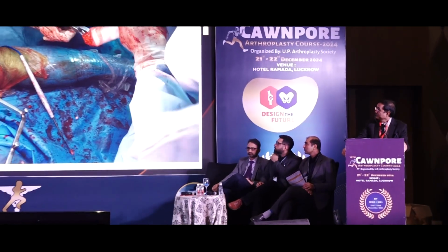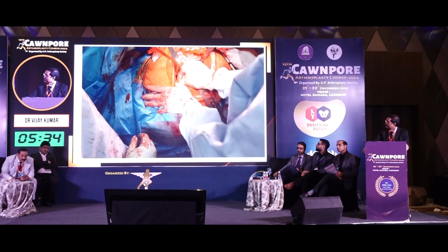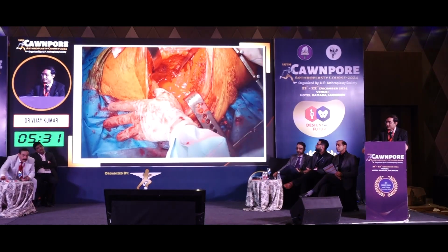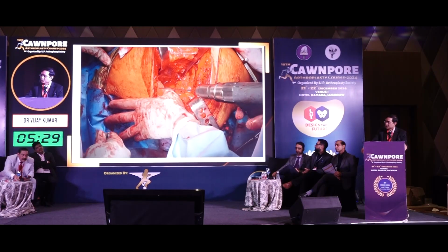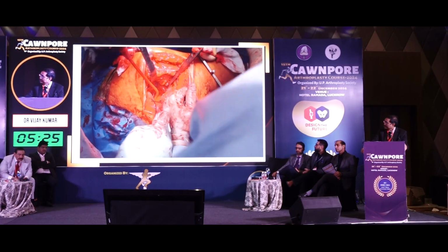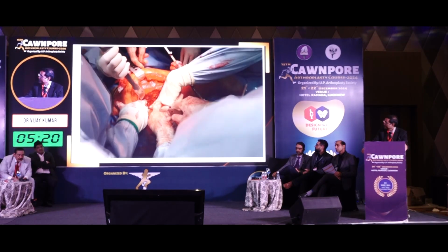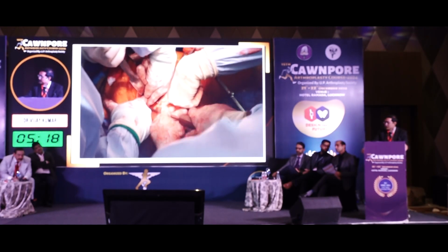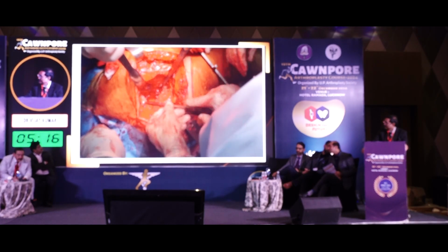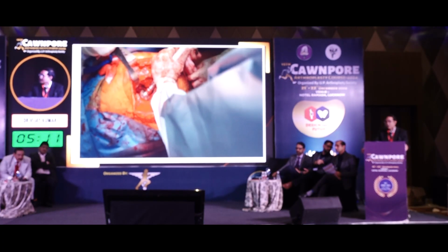this is how do you put a femoral head? So if you see there's a big defect there, so you put in the head and then you need to shape the head according to the defect, take out the cartilage along it, try to place it there, and it's usually a posterior superior defect. Provisionally hold it with 2 K-wires, right? And then once it has been held, you put some partially threaded cancellous screws. Usually you have to put 2 screws, you would not rely on 1, and once the screws are in, you have a fair amount of stability. It decreases the size of your cup also.